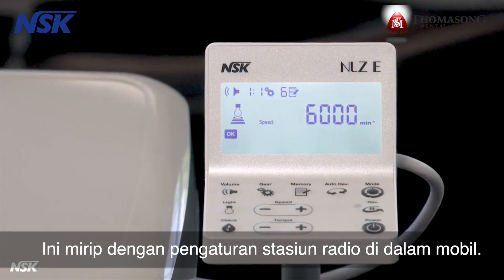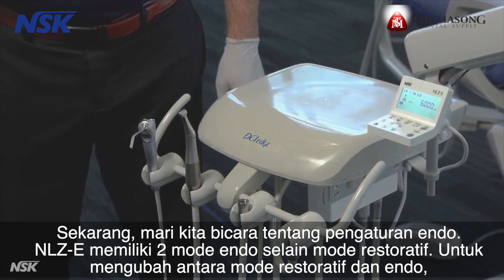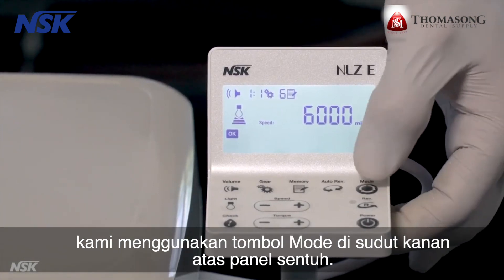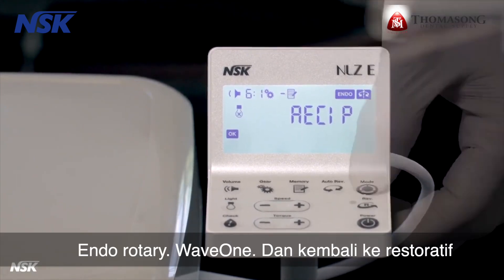Now let's talk about endo settings. The NLZ-E has two endo modes in addition to the restorative mode. To change between restorative and endo modes, use the mode button on the top right corner of the touch panel: endo rotary, wave one, and back to restorative.